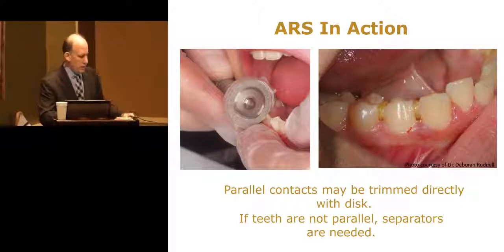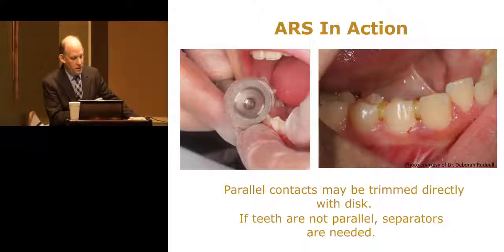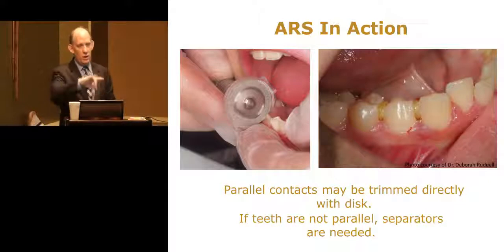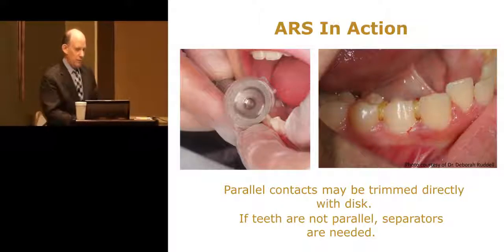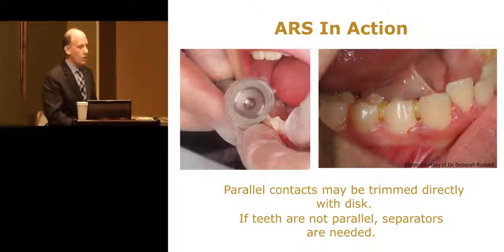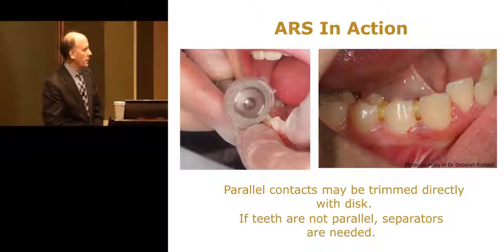In the original book from Sheridan, he suggests putting in some rubber separators for a few minutes before you use a disc to create some space, and it's not a bad idea. The disc is spinning so that the disc is turning towards the gingival margin. Yeah, so it's throwing the disc into the tooth, if you will. If you go towards the lip, you could very easily catch a lip, so I don't want to do that.